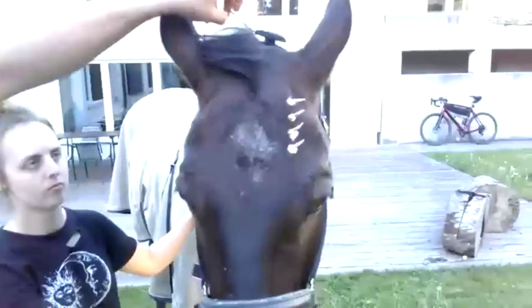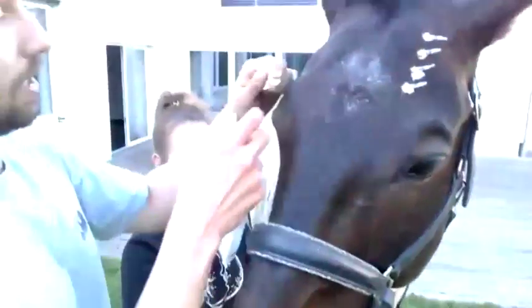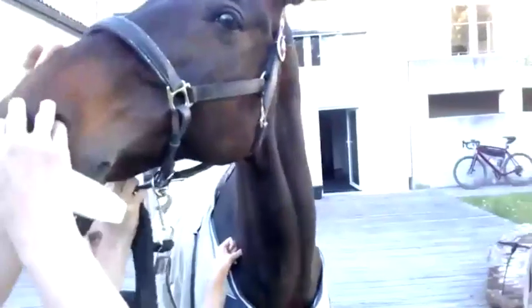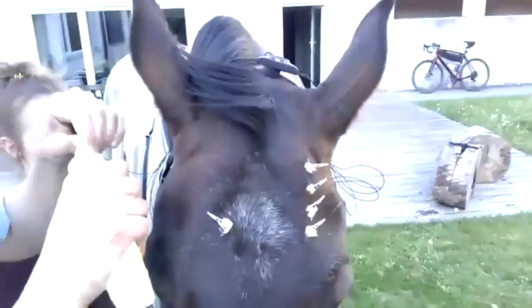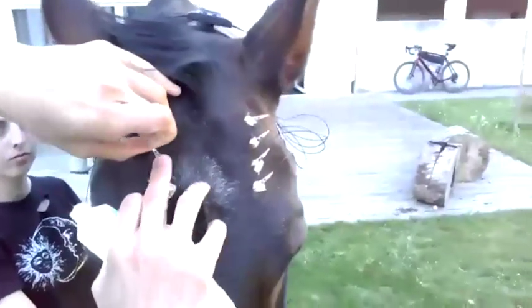Okay, so we now go to the other side and do the same. It's very easy. I'll try to place them now a bit more centrally. I was a bit far with this row, but now I'm going to be fully central. Now you can see here I try to remove the hair a bit.